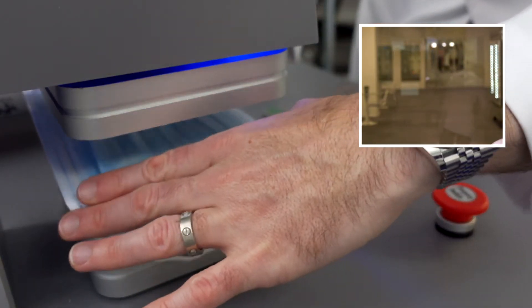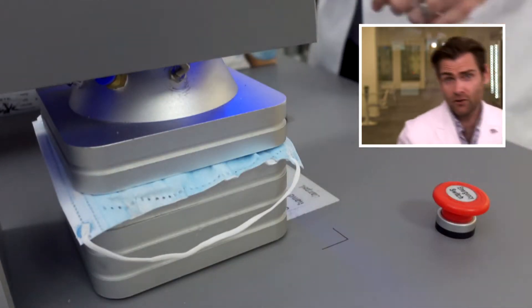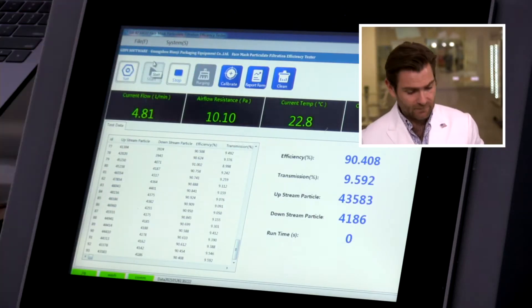The Clamp-tastic 9000, the Clampinator, the Clamp-a-Lama-Ding-Dong. Those are all technical terms by the way. All right, let's let it rip, see how this puppy does.